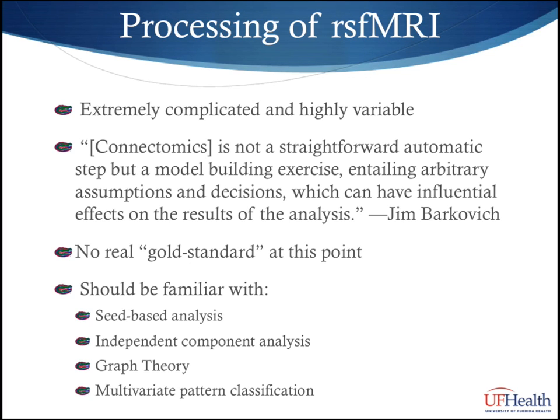I would say one should be at least familiar with some of the more common methodologies of analyzing resting state functional MRI data. The first method is so-called seed-based approaches, which are similar to DTI, where you interrogate a specific area to determine its relationship with other areas in the brain. For example, if a region of interest was placed in the left motor cortex, we would expect to see all areas in the brain which have resting state communication with this area, such as the contralateral motor cortex through interhemispheric association fibers. This type of analysis is ideal for answering a direct question, but has limitations given that there are a priori decisions made about which areas to interrogate.